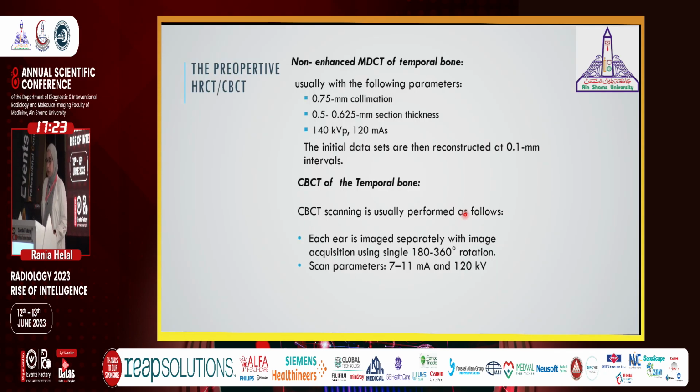The preoperative protocol should include both high-resolution CT and MRI. And recently, this high-resolution CT is replaced in many centers worldwide with the CBCT, what's called cone beam CT. Here is the usual protocol we use in the high-resolution CT, and the initial data are then reconstructed at 0.1 millimeter intervals. This is the usual one used.